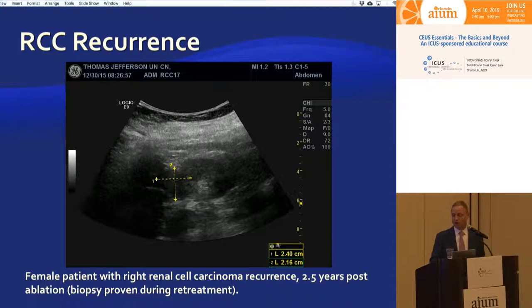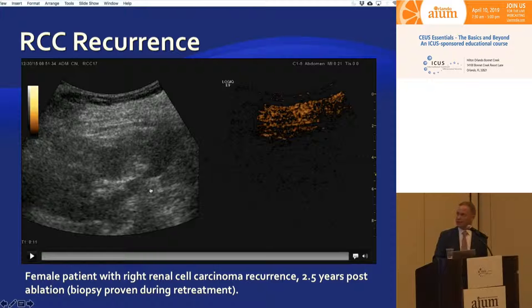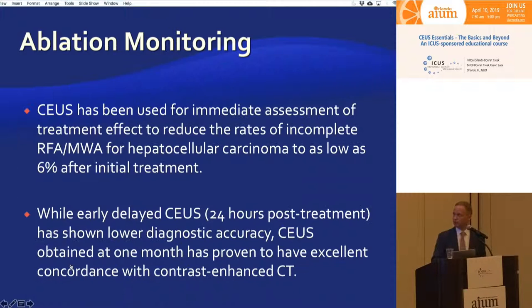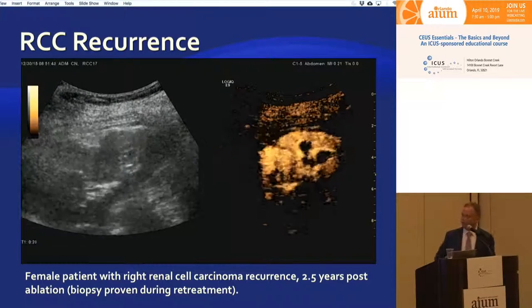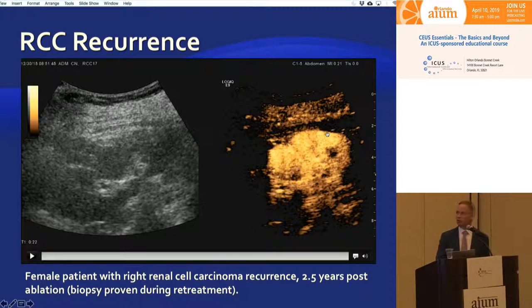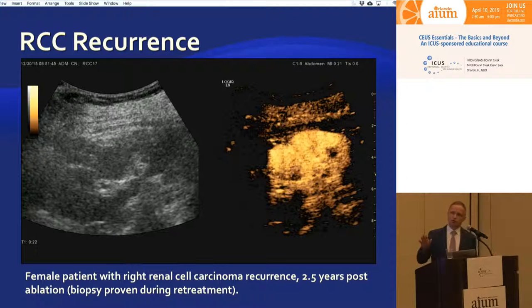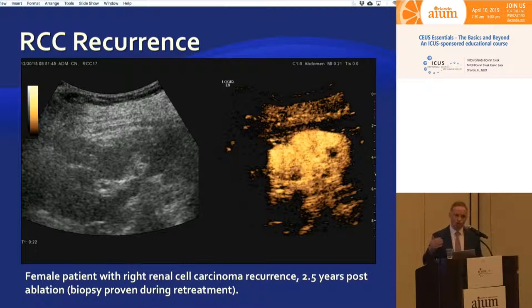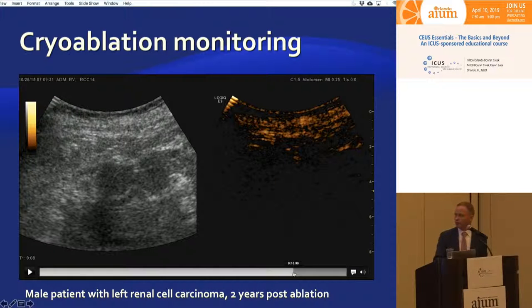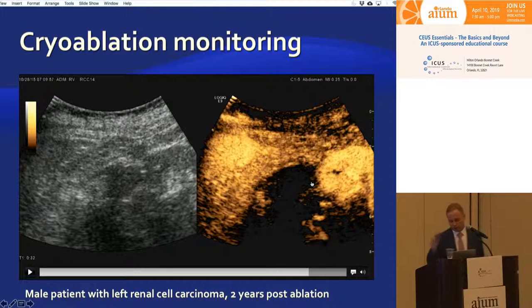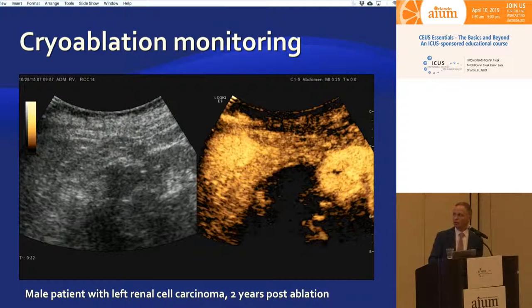Renal cell cancer recurrence will look very different. On an identical B-mode image, if you play the video you can see the whole area enhances avidly — as bright as renal cortex — with no doubt that it is recurrent tumor. Our interventional radiologists want us to tell them when they need to retreat a patient. Obvious recurrence needs retreatment; small microbubbles on the periphery of the lesion definitely do not. Gauge your reports based on clinical need for retreatment.